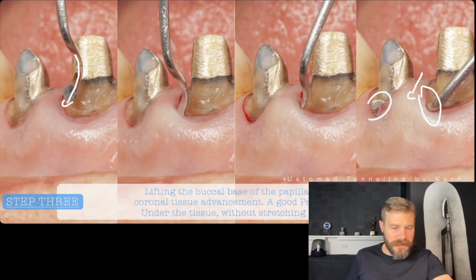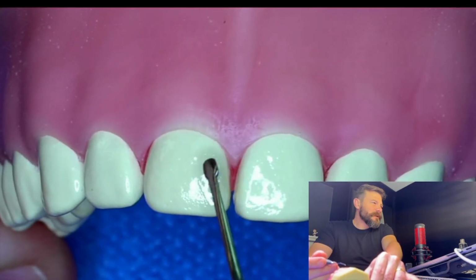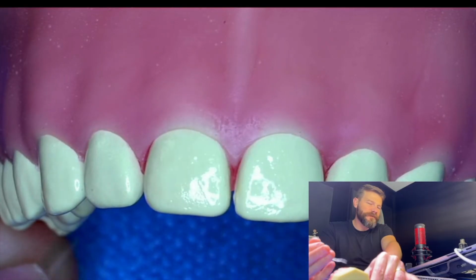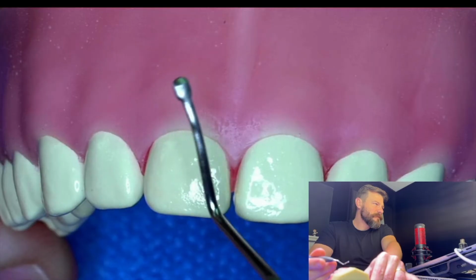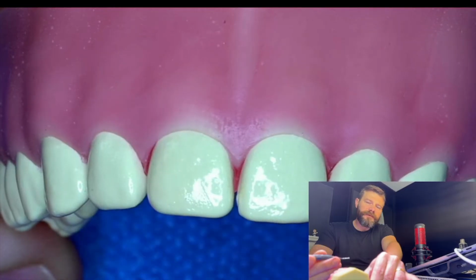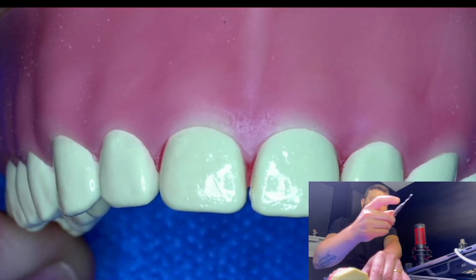So let's change the camera here to show the instruments to you. First, let's bring the box closer. Here we have a macro camera for us to check. So let's bring the model. The first instrument I described to you was this super nice and small tunneling instrument. Of course, both sides have different curvature, so you can use it in the anterior or posterior zone very easily, reaching every different spot, okay?